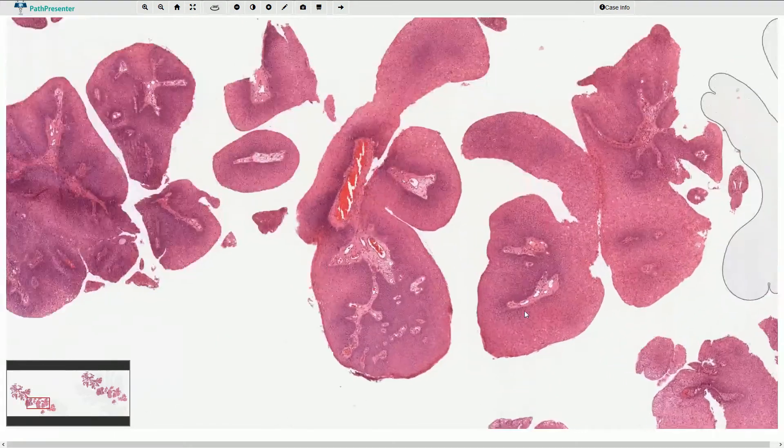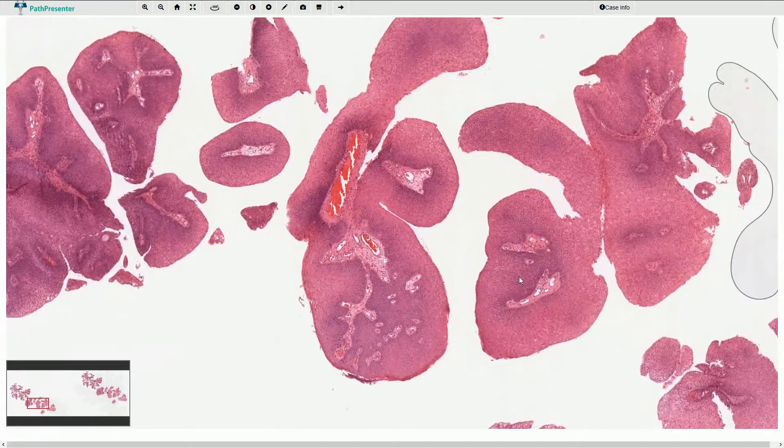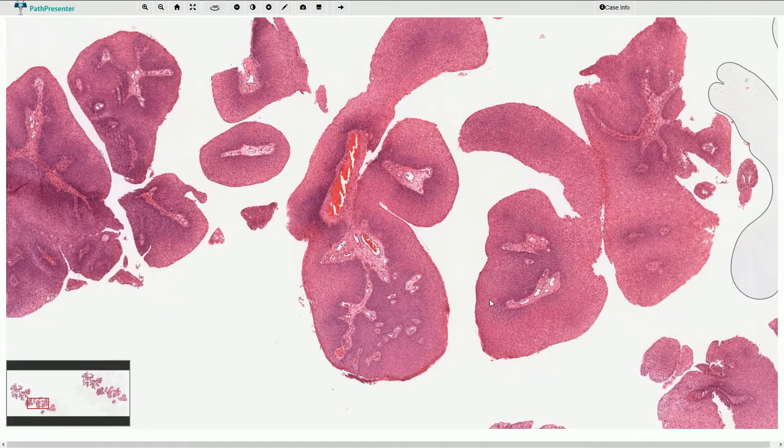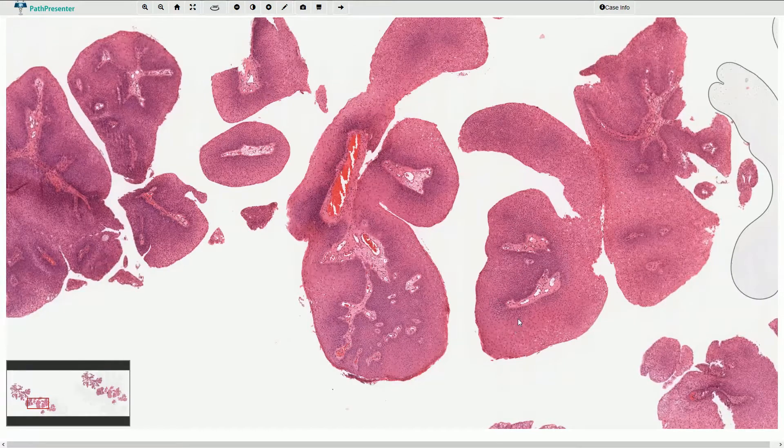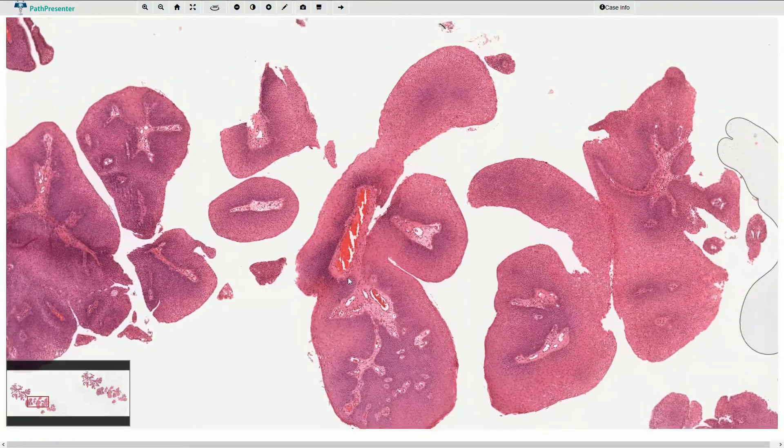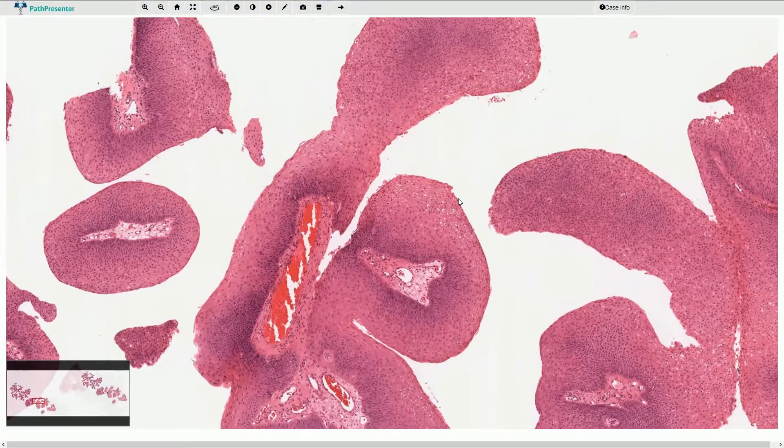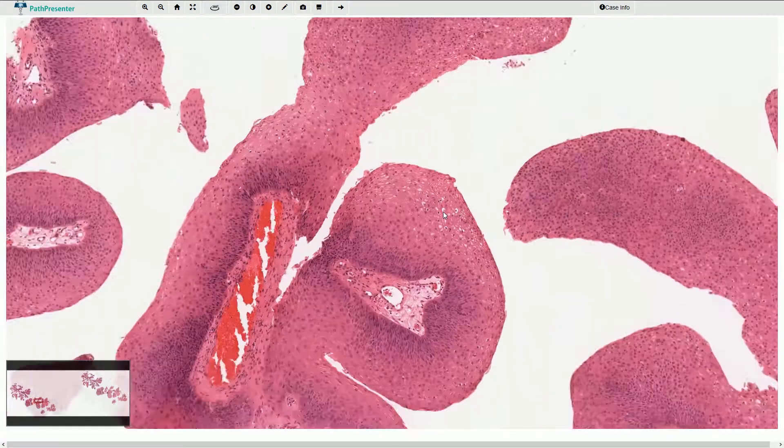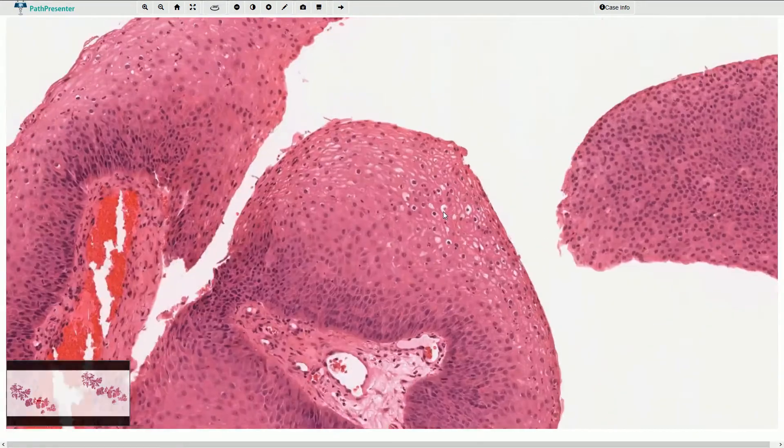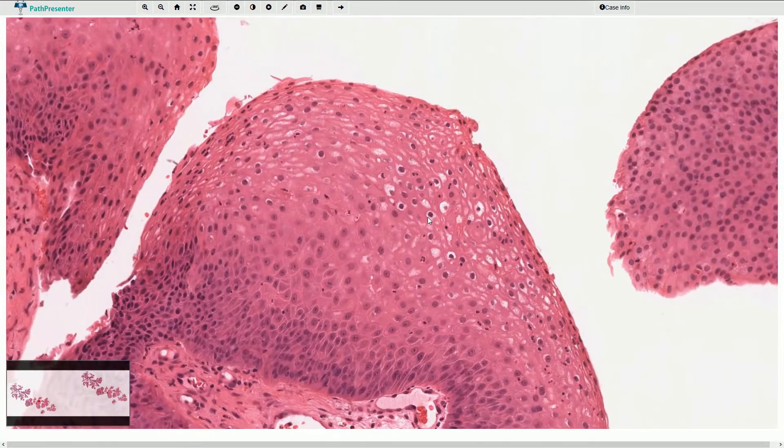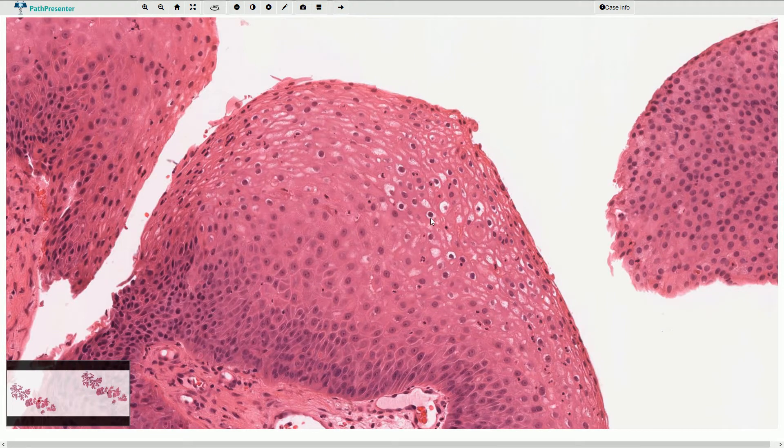In this part, the stratified squamous epithelium is slightly hypertrophic. Again, we can see koilocytic changes with slightly irregular hyperchromatic nuclei and clear halos around the cells.